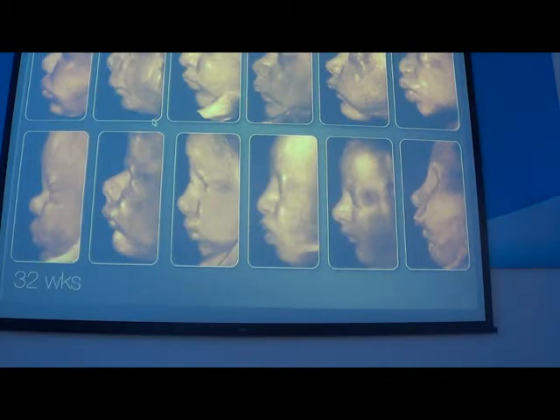Because all the babies are different, it's difficult to do the diagnostic only on the profile view.